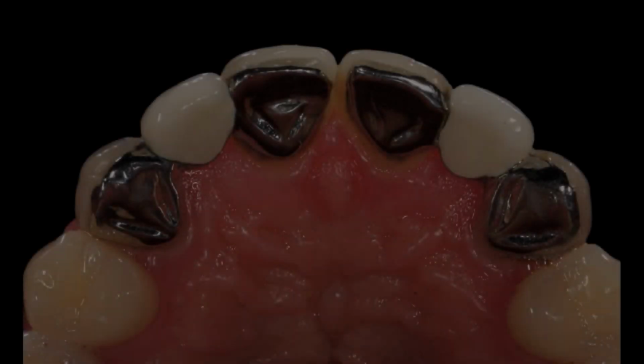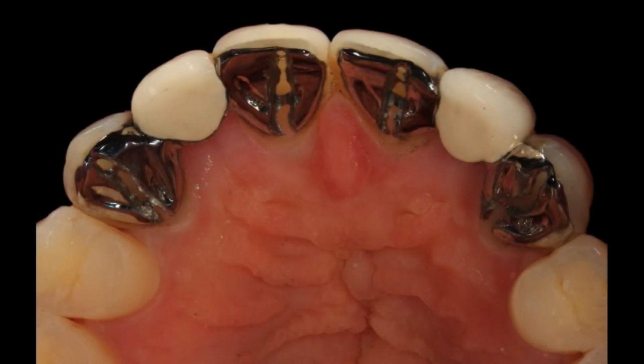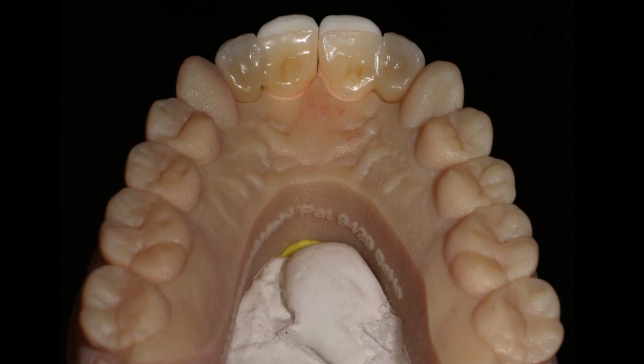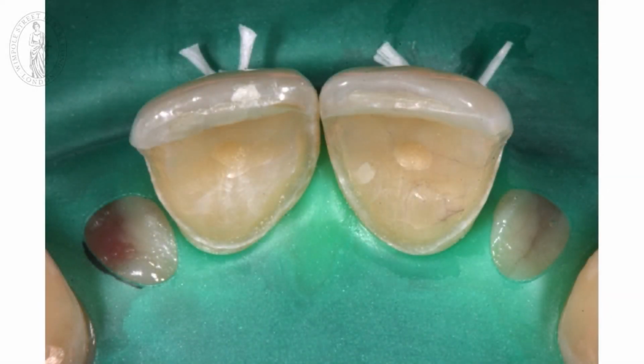So what we did is, firstly, take a picture from behind. This bridge will last you a long time, but it's just not acceptable with regards to how it looks. And so we cut the metal framework, gave some injection, adjusted the gums a little bit, made a splint which you could wear at night, and then prepared the teeth on the same day. You can see here as well, we've got better colors, even from the palatal side, from the inside. So that looks really perfect now. And after 1 week, we're ready to place a bridge. See, the gums look perfect as well. And of course we place the bridge with a rubber dam.